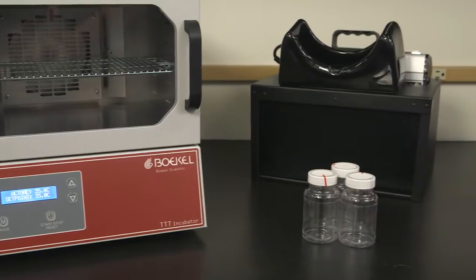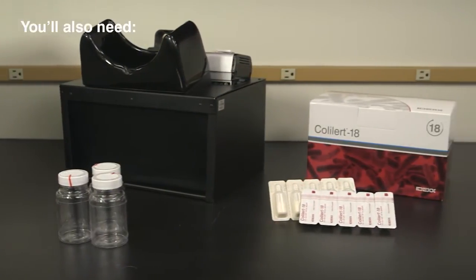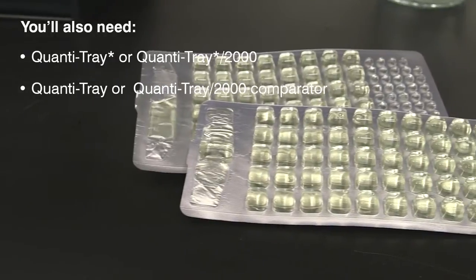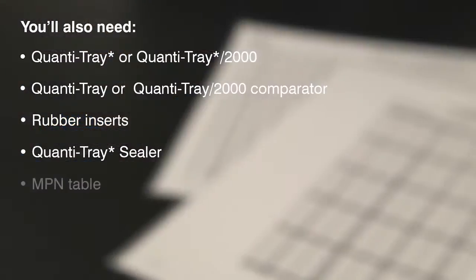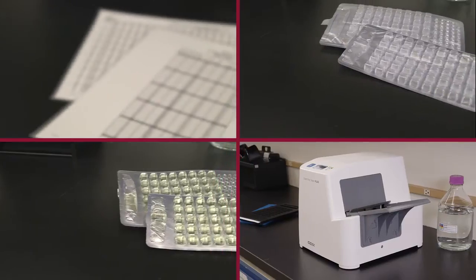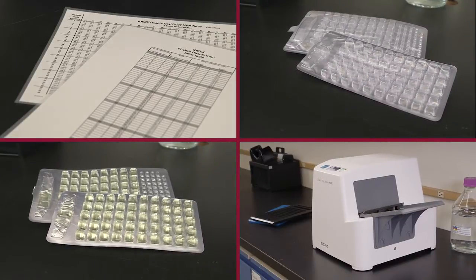In addition to the materials used for presence-absence detection, for quantification you will need a QuantaTray or QuantaTray 2000, a QuantaTray comparator, QuantaTray rubber inserts, a QuantaTray sealer, and the included most probable number table or the IDEXX automated MPN generator program found at IDEXX.com. All of these items are included in the QuantaTray system and are available from IDEXX.